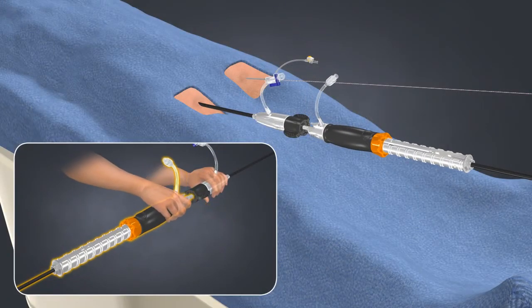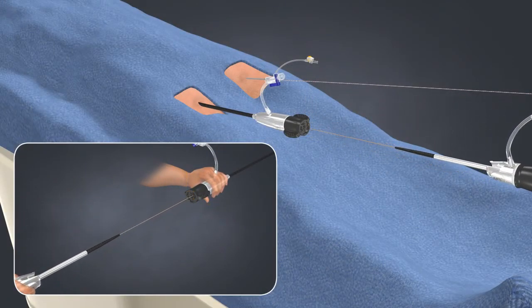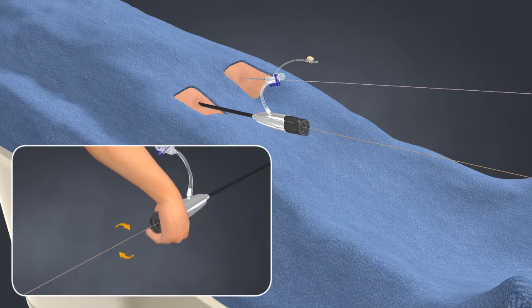Release the extension delivery system and then remove. Upon removal, tighten the hemostasis valve.